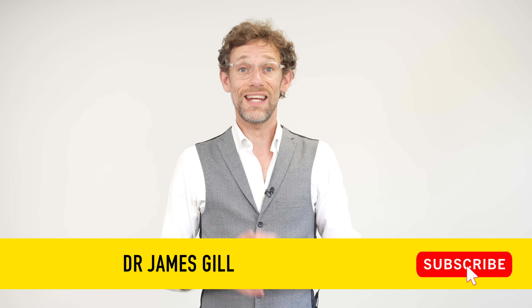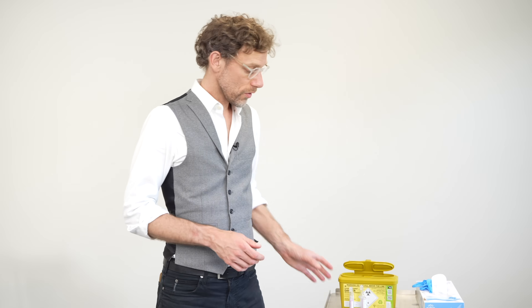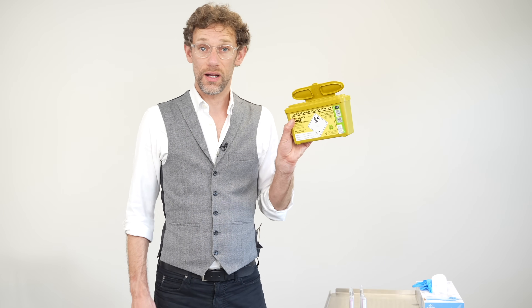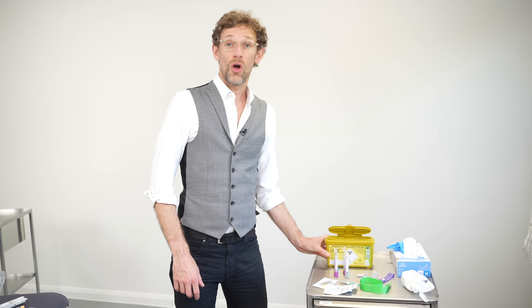Doing a blood draw is easy, and one of the ways you can make that easier is with appropriate prep — getting your kit ready before you go and see the patient. The very most important thing on the entire tray is the sharps bin. Without that, you are just not going to progress forwards. Without the sharps bin, you're putting your patient, your colleagues, and yourself at risk of a sharps injury.